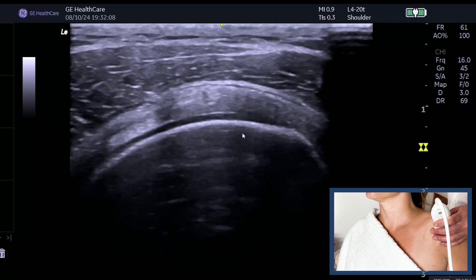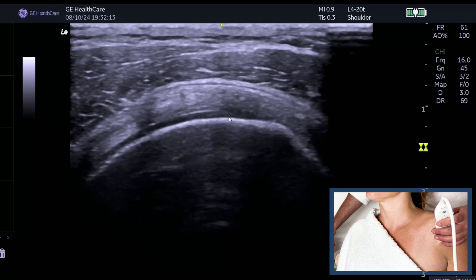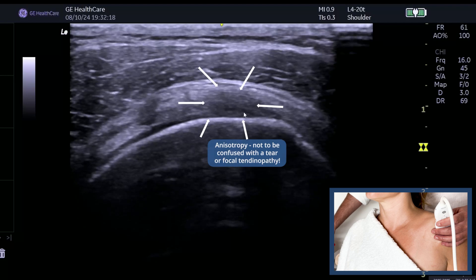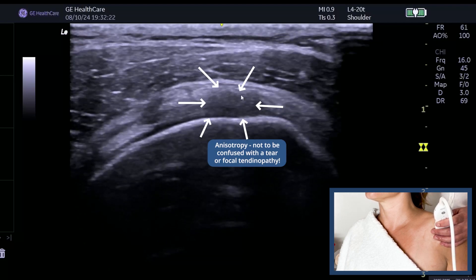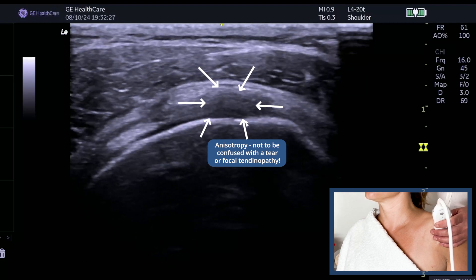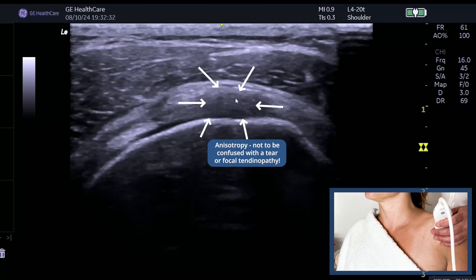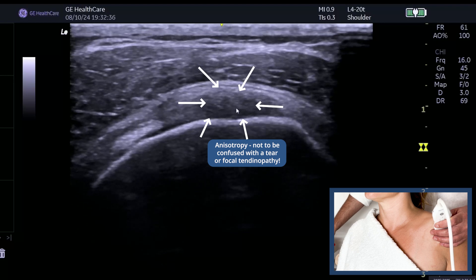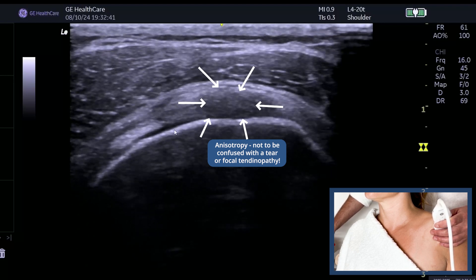Watch this: as soon as I rotate and I'm no longer truly transverse — you can tell because I've lost that nice parallel band of articular cartilage — I start to see dark patches. That's because I'm oblique, and that is anisotropy. It is so important that if you're scanning transverse, you are truly transverse, otherwise you'll pick up dark patches that you think is either tendinopathy or an articular-sided tear. When we're oblique, this is no longer a parallel band and you can't see the parallel band of articular cartilage.